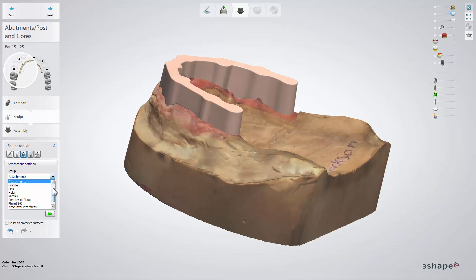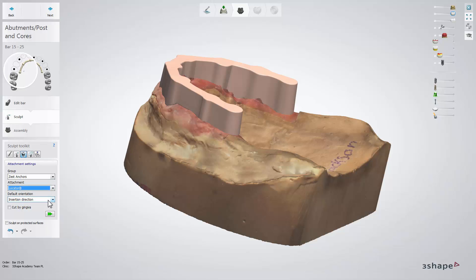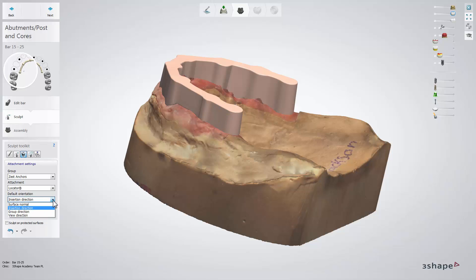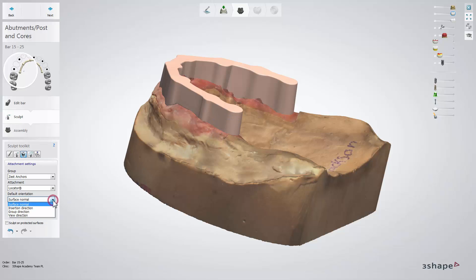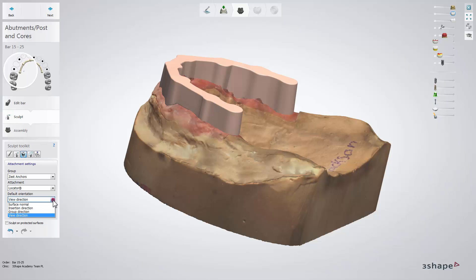To add an attachment, go to the attachment settings. Find the desired group and type of attachment and set the default orientation, then place it on the bar. There are four types of orientation: insertion direction — according to the insertion direction line; surface normal — according to the plane surface of the bar; view direction — in relation to the viewing point; and group direction — where attachments are grouped.